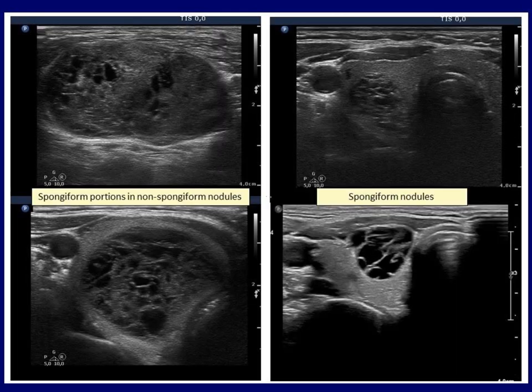A spongiform pattern is not a rare finding, but it must be a true spongiform cyst. We call a pattern spongiform if it contains small cystic chambers divided by fibrous septa and does not present solid portions. A spongiform nodule is classified differently in various guidelines. Some guidelines are content with the proportion of spongiform parts exceeding 50%, while for example the ETA speaks of a spongiform nodule if the entire lesion is composed of spongiform areas. The case on the left is by no means a spongiform nodule, as we see spongiform areas in only a very small part of the lesion.